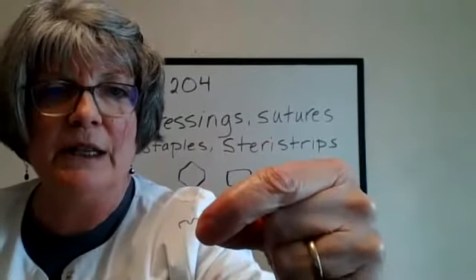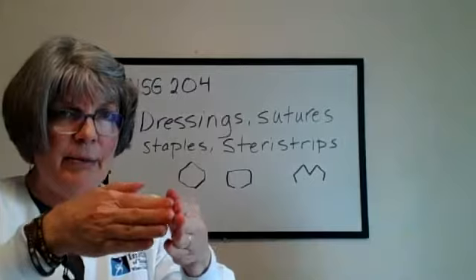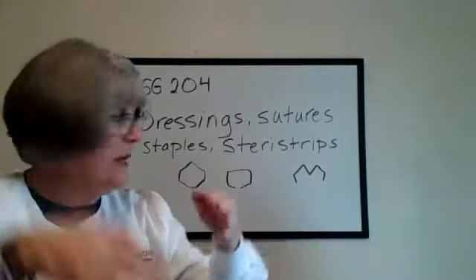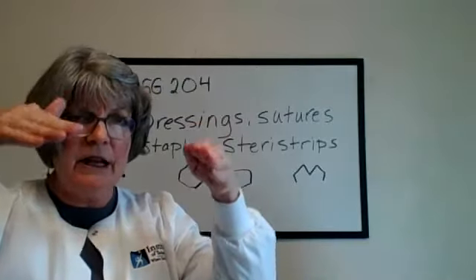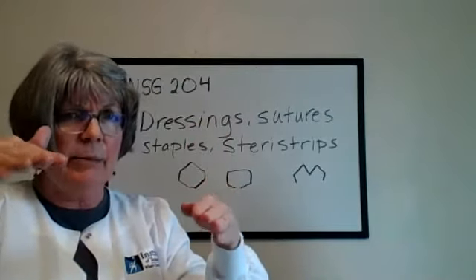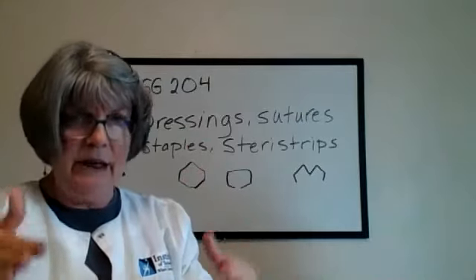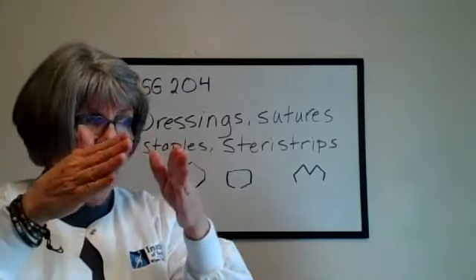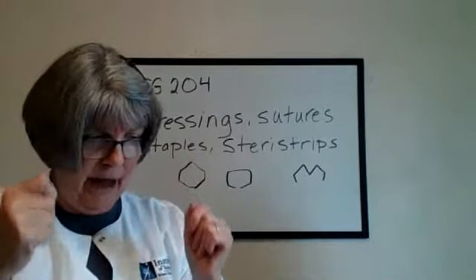I don't know if you can see that very well, but it pushes down the center of the staple, and that then pulls these edges apart so that it pulls it up out of the skin, and it'll kind of stick in the skin a little bit. Just do a little gentle rocking motion, and that will help to release it. But it just helps to open that up so that you can pull the staple out.